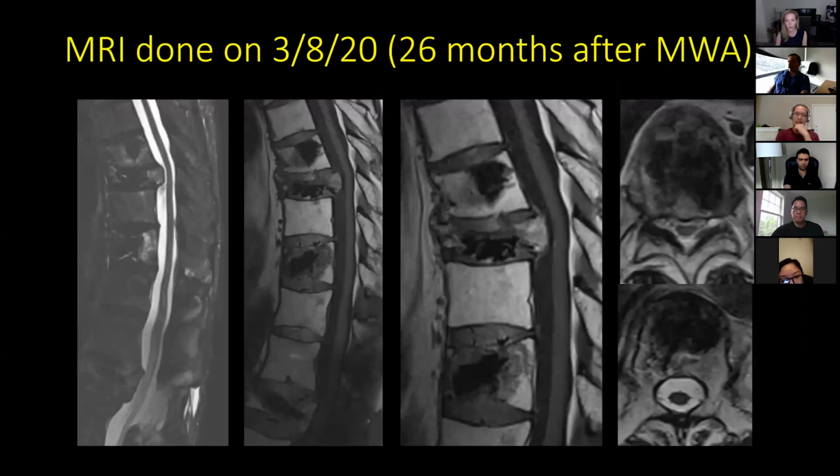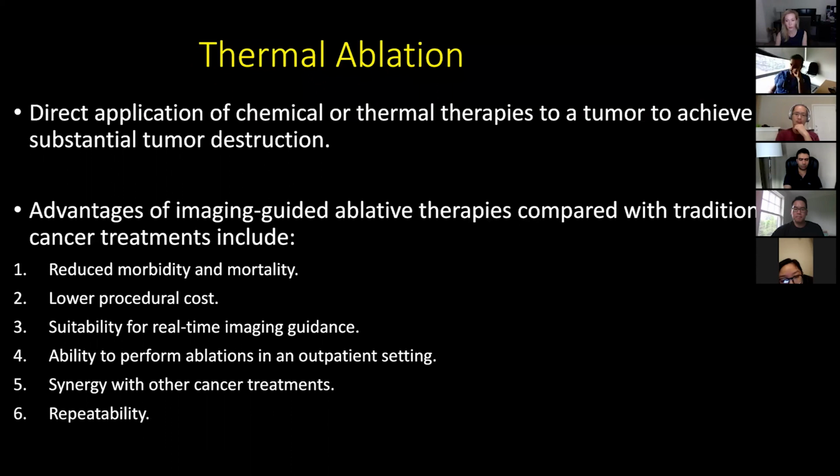So that brings us to the ablation portion. You can do a thermal-based ablation and you can do ice-based ablation. The thermal-based is radiofrequency ablation, and of course cryoablation is on the ice-based side. But in the last 4 or 5 years, another modality has come in, which is microwave ablation, and there are certain others coming up like lasers.